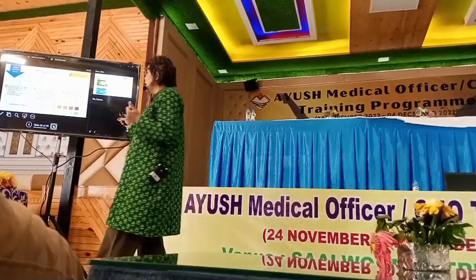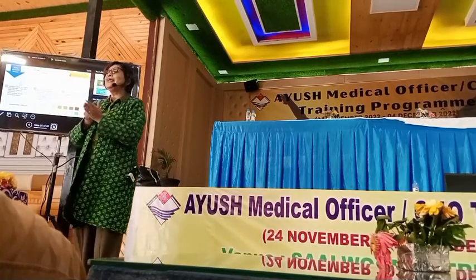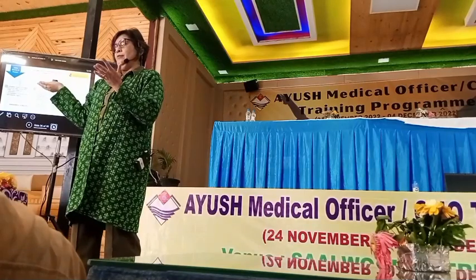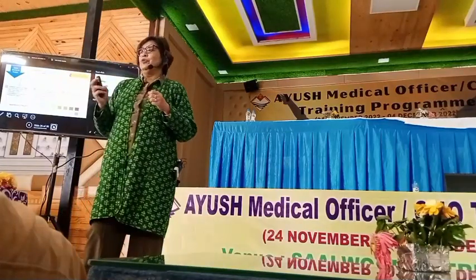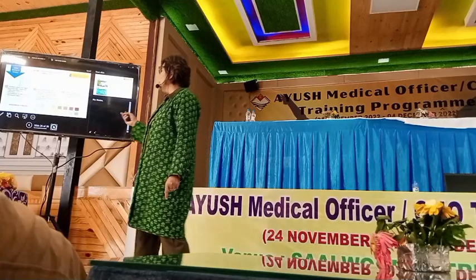इसमें आपकी एल्ब्यूमिन आएगी, प्रोटीन हाई आ रही है, कम नहीं आ रही। देयर इज नो थिंग कि कम है, कम ब्लड टेस्ट से होगा। इसमें केवल हाई दिखेगा कि प्रेजेंट है कि नहीं। एमएयू आती है अलग टेस्ट है, माइक्रो एल्ब्यूमिन। अच्छा, वो रीनल क्या केस में होगा। So I got it now.